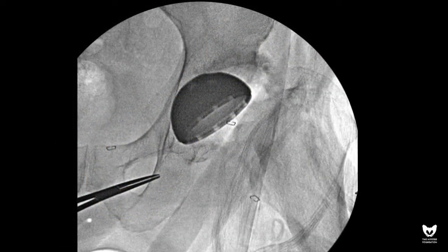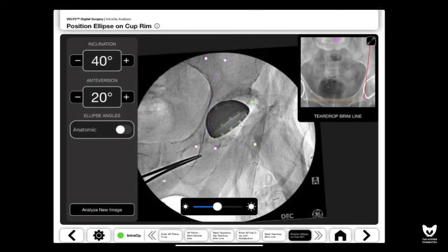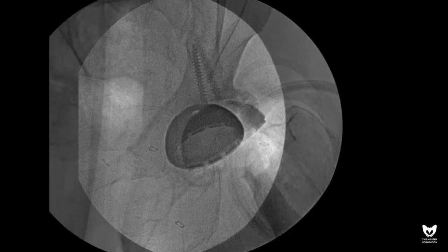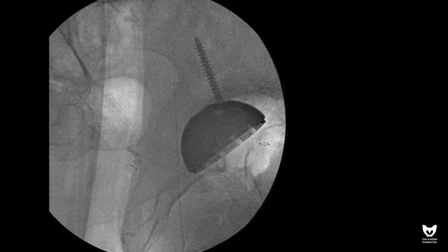The definitive acetabular component is placed under direct fluoroscopic control with the goal of replicating appropriate anteversion and inclination as defined by our preoperative plan. The cup is provisionally secured between the columns and screw fixation is obtained. Care is taken to check and recheck acetabular component position, as application of very strong screw fixation may create minor alterations in cup position.